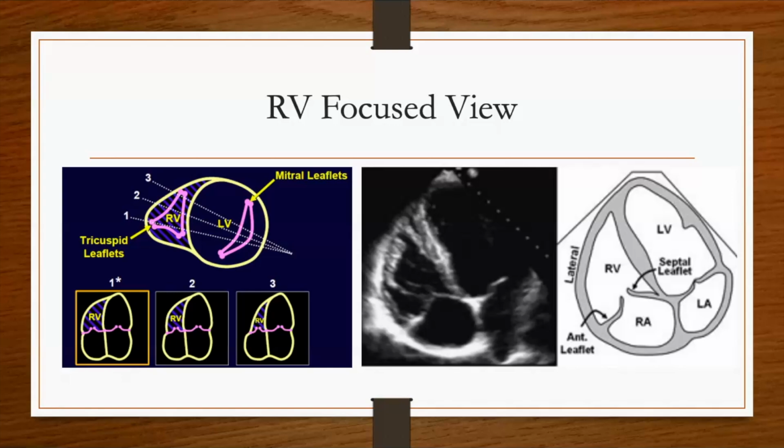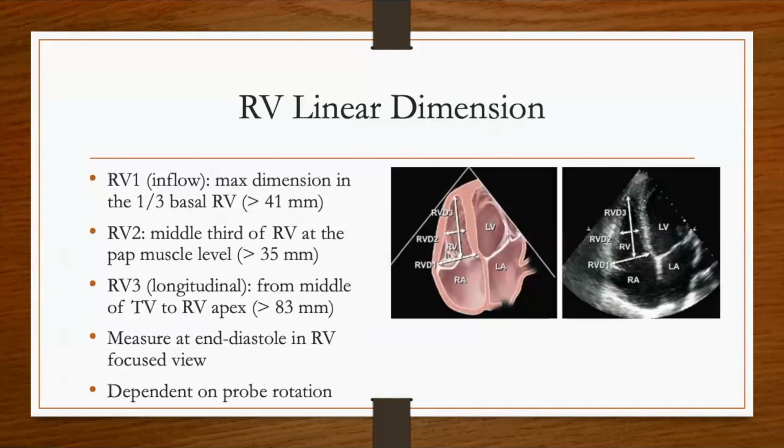I have a comment regarding the measurement of the basal RV diameter. Sometimes, even in the images just now, some will measure this area exactly at the annulus. The key is don't measure the tricuspid annulus. That's a good one. You measure myocardium to myocardium, and ideally the tips of the tricuspid leaflets are probably the best landmark. Just be aware of trabeculations on the RV lateral wall.